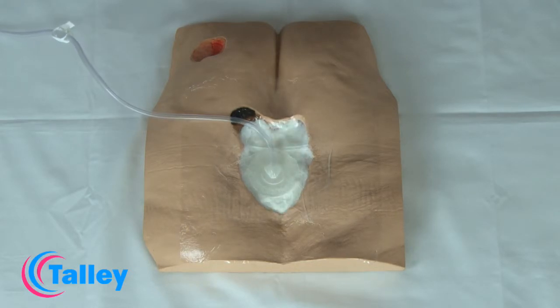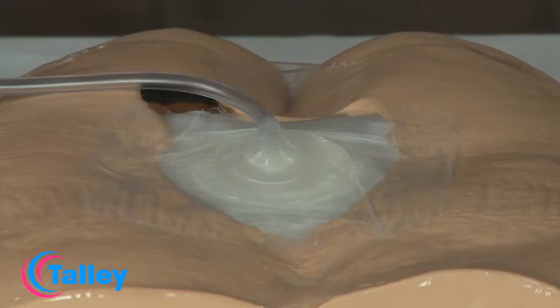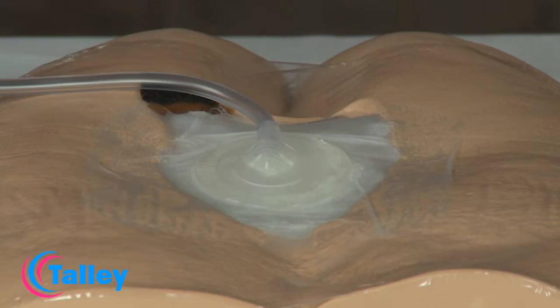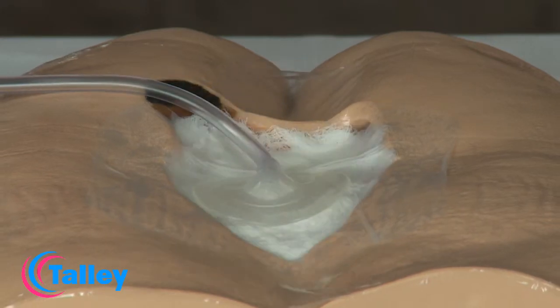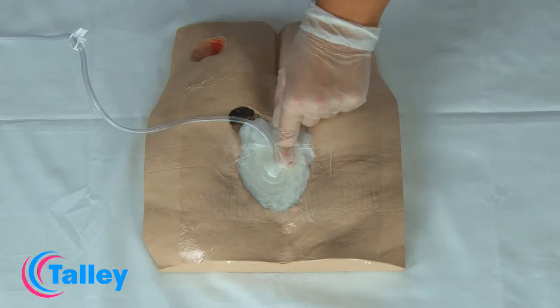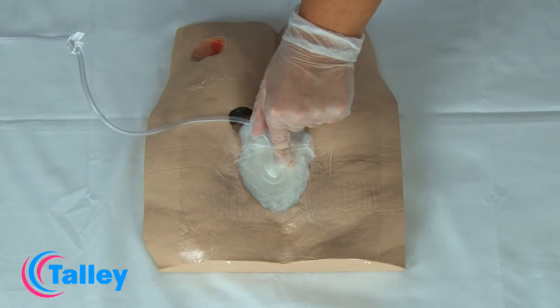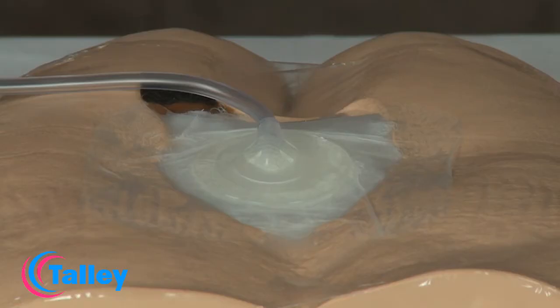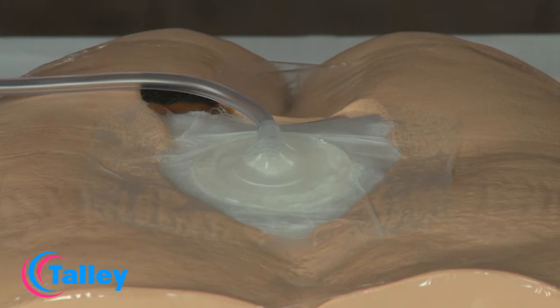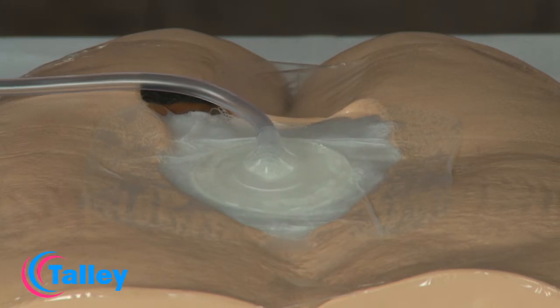Once the power unit is running, observe the wound site. The dressing should contract noticeably, becoming firm to the touch. If the dressing fails to contract, then it has not been completely sealed. To rectify this, reinforce the dressing seal and/or adjust the portal drain, and initiate suction again.